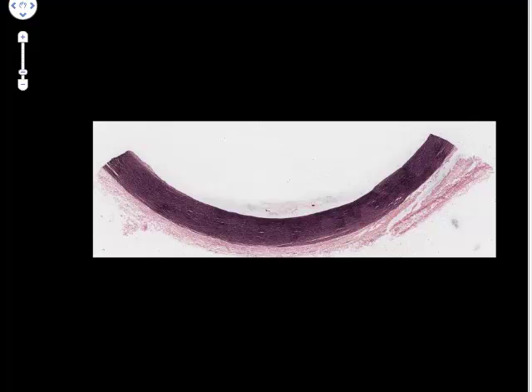Now we're going to look at two specialist types of connective tissue fibers found in particular abundance in specific tissues: elastic fibers and reticular fibers. Let's begin with elastic fibers.